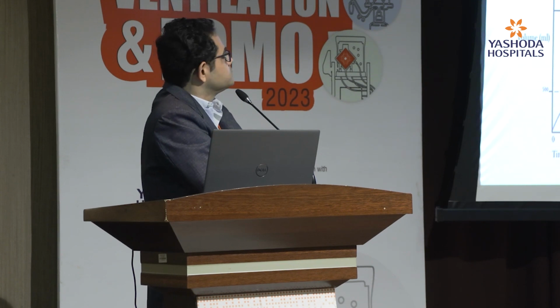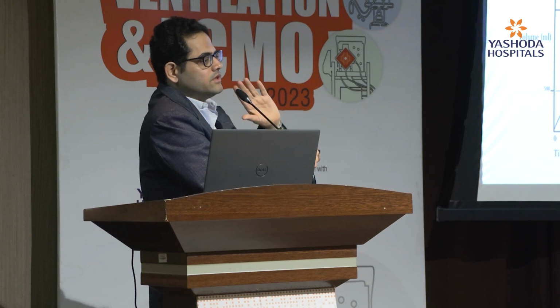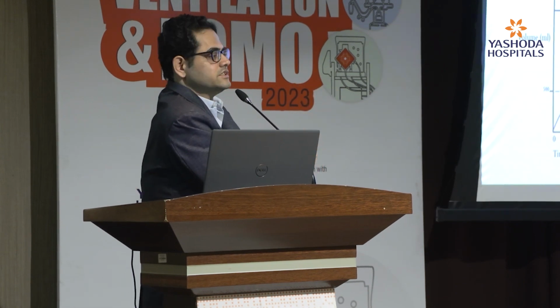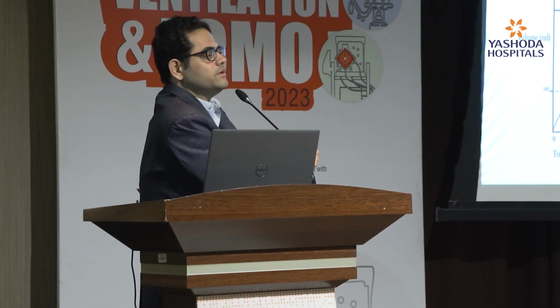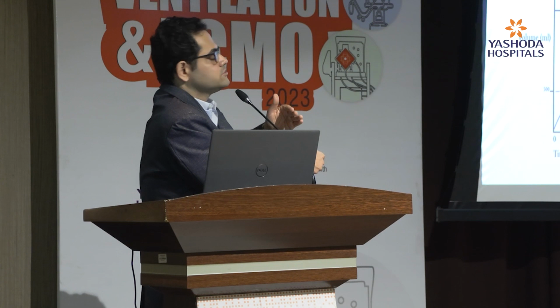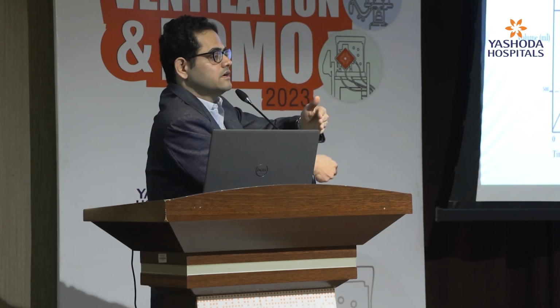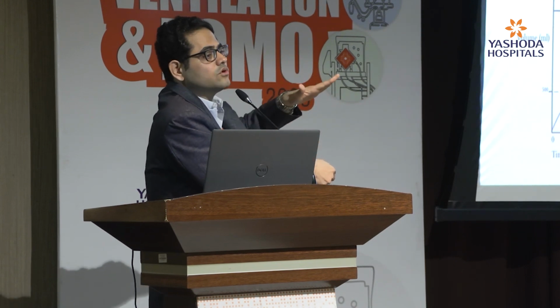Now limit variables. Limit means what factor is limited or controlled by the ventilator. This is volume limited, means at any point of time volume will be constant. Here you see the pressure graph, usually it is like an elliptical portion, but the flow will always be constant. Usually it is a square waveform. Your ventilator also has a decelerating flow pattern. So the pressure may rise in the volume control ventilation. Why? Because the compliance is worsening. So the ventilator will give the fixed volume. Pressure may go up. There is no control on the pressure.